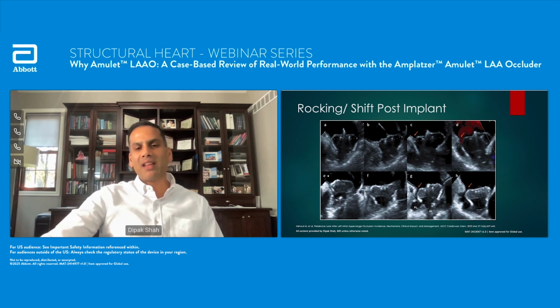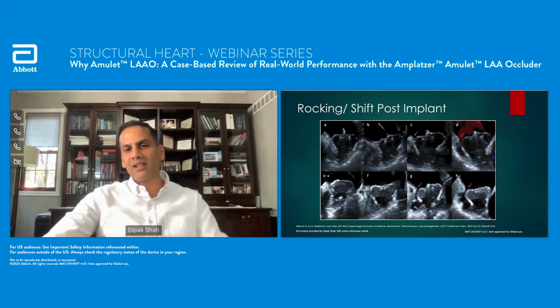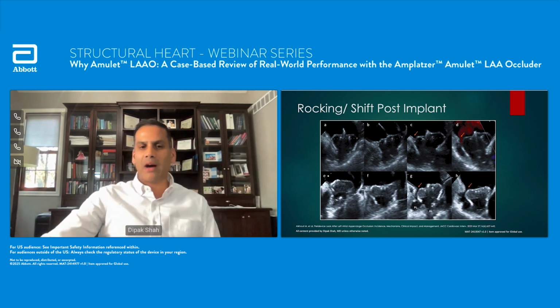And then what they see on that 45-day TE, and this is not all too uncommon, is that the device gets sucked in a little bit deeper and kind of rotates a little bit counterclockwise. And now you have a significant leak, and now you have flow into the left atrial appendage.